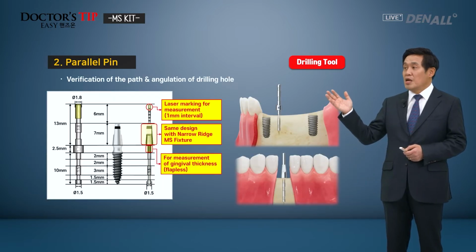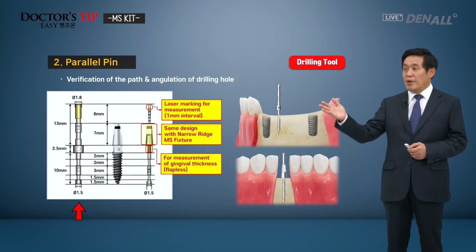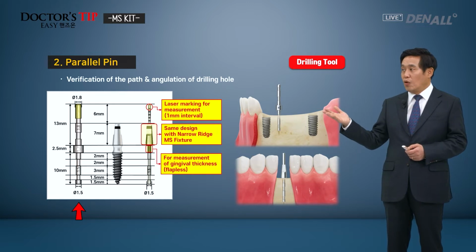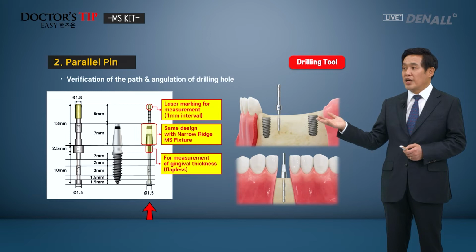As I briefly mentioned, for the parallel pin, you have the conventional type, and also, even in that structure, to check the millimeters more easily, you have a thickness difference for comparison. And one special thing, the upper part of the MS fixture has the same design. So it has the same narrow fixture design, so that in designing the final prosthesis and planning, you can use this as a reference or guide.